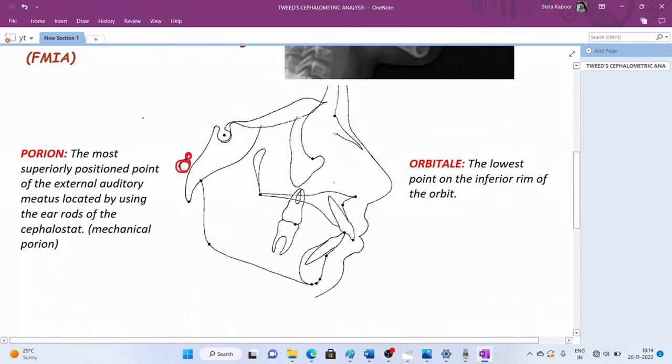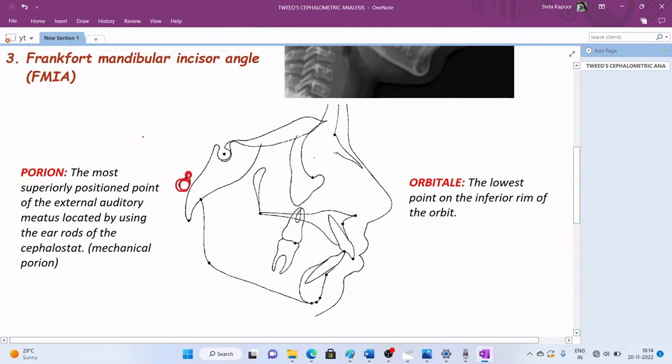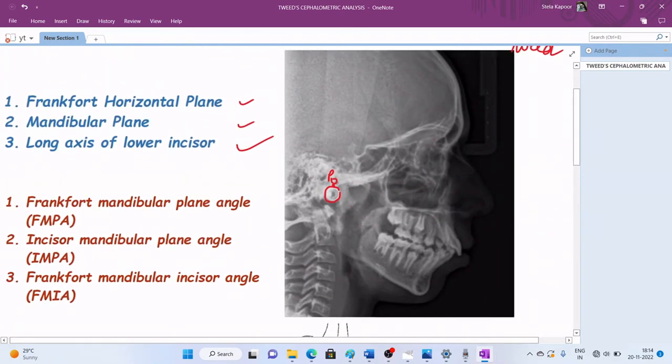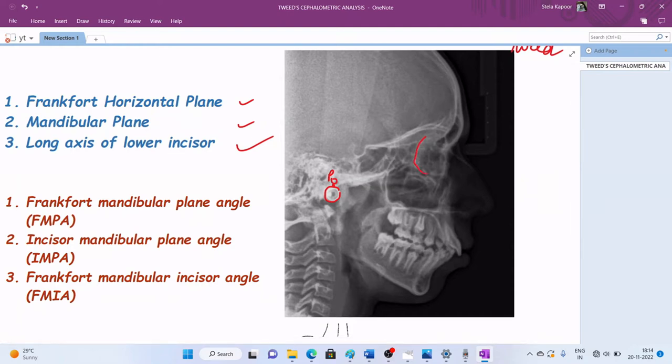Now for the second point, orbitale. This is the lowest point on the inferior rim of the orbit. This is our orbit rim, the inferior border, and this point is the most inferior point. In this cephalogram, we can make out this slightly radiopaque rim. The lowest point of this is the point orbitale.